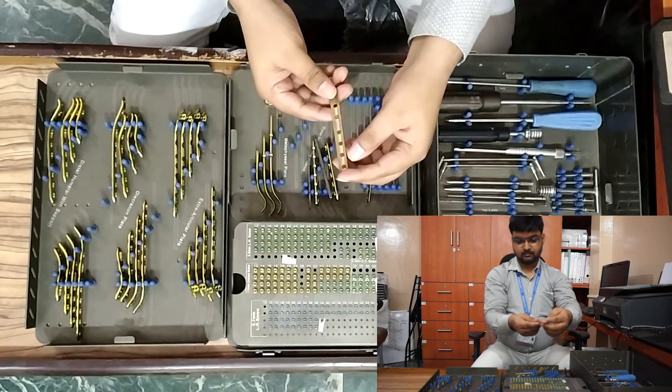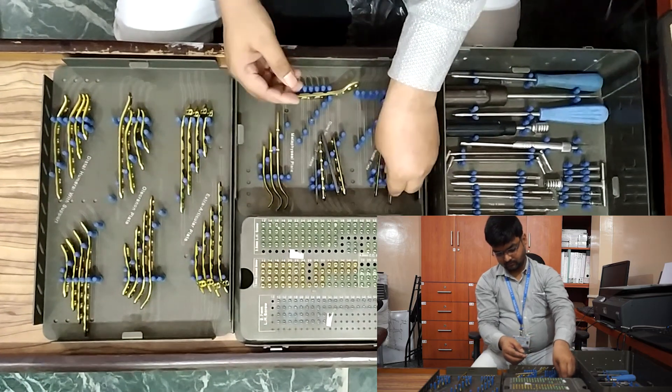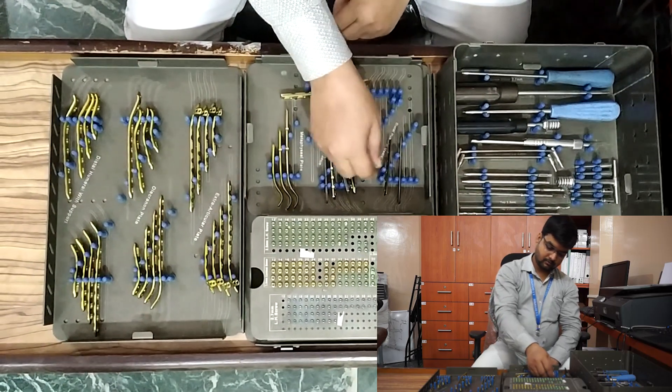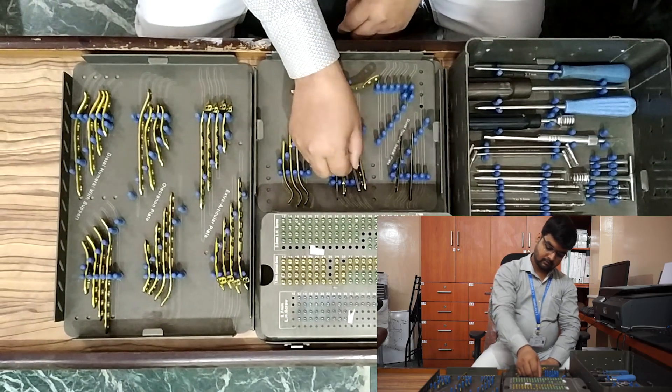Now, recon plate, small DCP, and one-third tubular plates — these are universal straight plates. They do not come with a right side or left side.